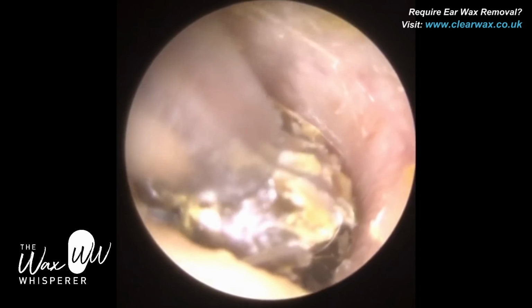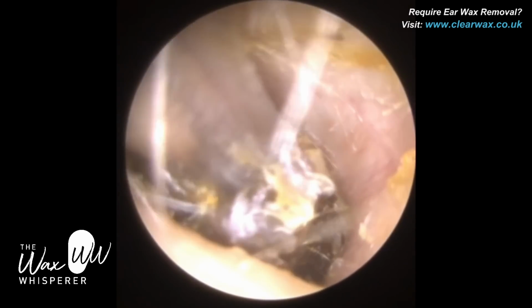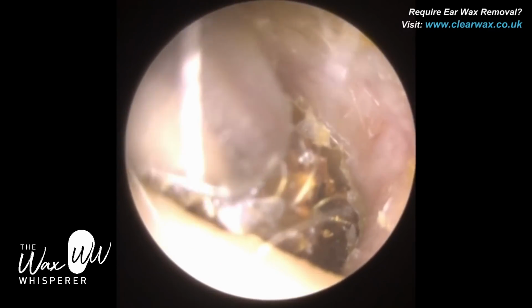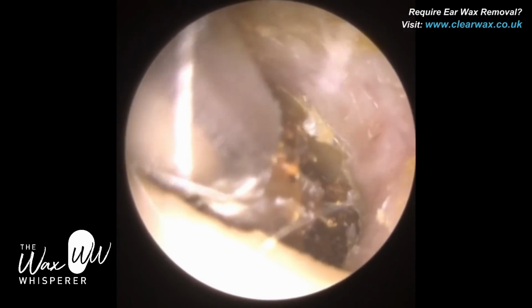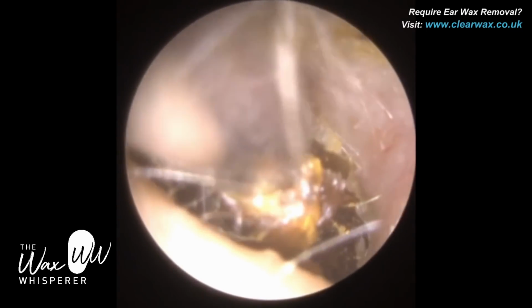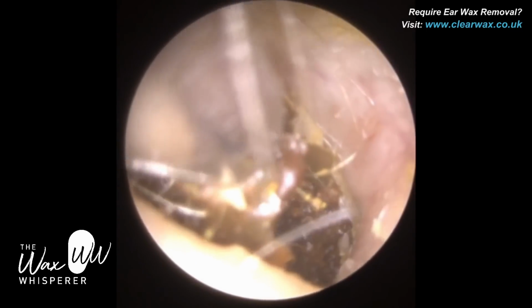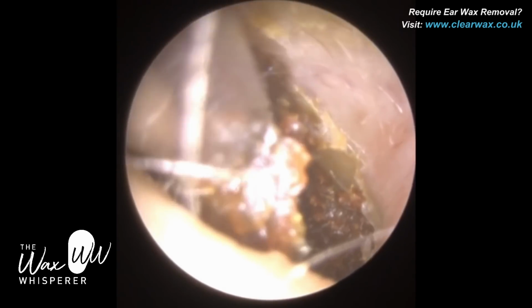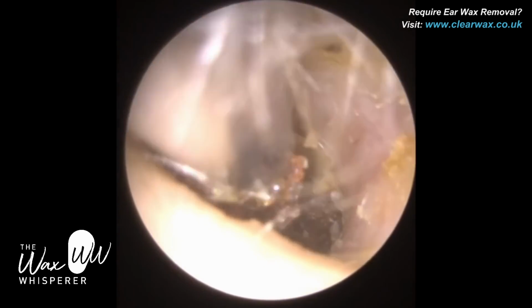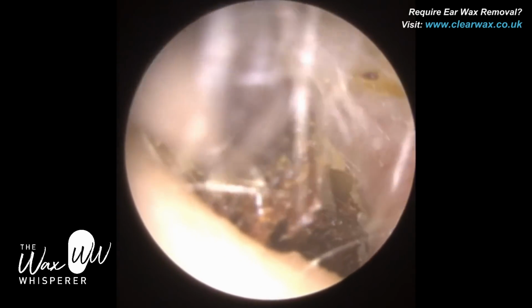There are two bends in the ear canal. At the most extreme, the second bend can be at an orientation of 45 degrees, and I suspect this patient has got a 45-degree bend ear canal. The only way we can really know that for sure is if we take an ear impression, so we take a cast of the ear and then we can analyse the impression and the bends. But it was probably one of the bendiest ears I've performed the procedure in.